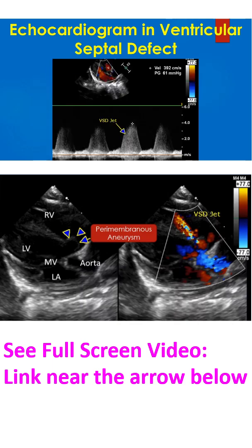The right panel shows the reddish mosaic multicolored jet through the ventricular septal defect. Continuous wave Doppler interrogation of the ventricular septal defect showed a pansystolic jet with a peak gradient of 61 mmHg. This represents the difference between the systolic pressures of the LV and RV. In a large VSD, when pressures in the two ventricles are nearly equal, the velocity of the VSD jet will be small and hence the gradient will be low. When the pressure gradient across the VSD is high, it usually means the VSD is restrictive — and here it is a restrictive VSD.